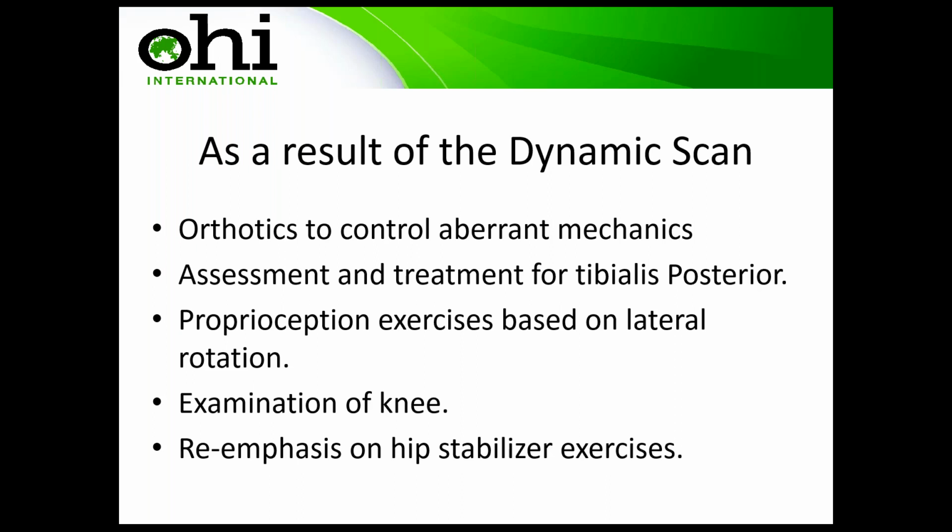You look at the knee, examine the knee. It's unlikely that a patient will come to you with no pain with internal derangement of the knee, with either a cruciate problem or a meniscal problem. But it's very common, something that I see, is patients come to me and they have a maltracking patella. They already have chondromalacia patella. They have a nice crunchy kneecap when you do the test, and they don't have a lot of pain with it. But again, they've got the rotation happening when they're walking.